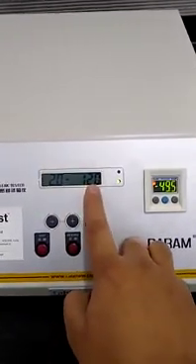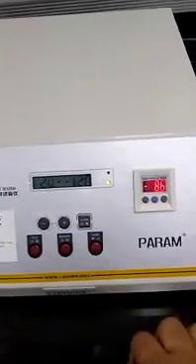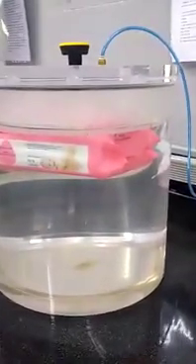The countdown has stopped. If I want to reverse the vacuum pressure, the reverse process starts now. There is no leakage detected.